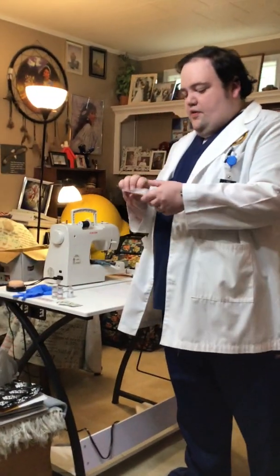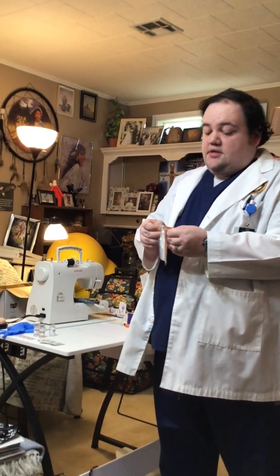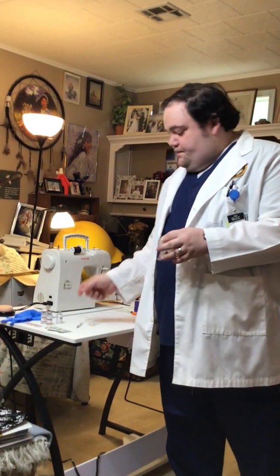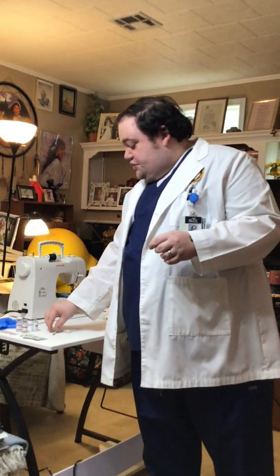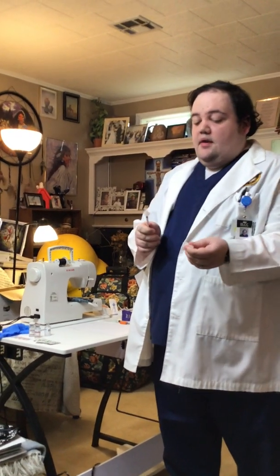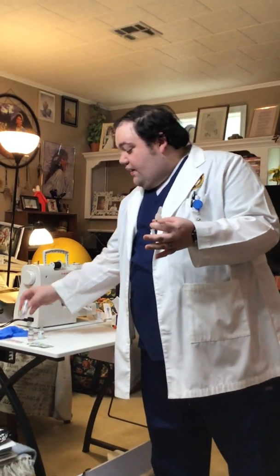And finally, this physician has ordered a PPD skin test, which is going to test for tuberculosis, or the presence of tuberculosis exposure. And so this one's pretty straightforward. It's going to be given intradermally, which is on the surface of the skin, in the dermis. Again, I'm not going to aspirate any air into the needle. I'm not going to inject any into the vial.